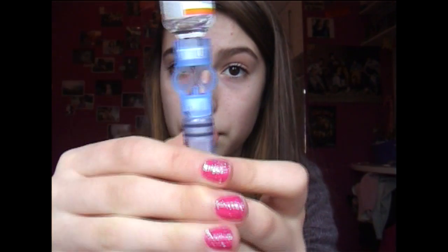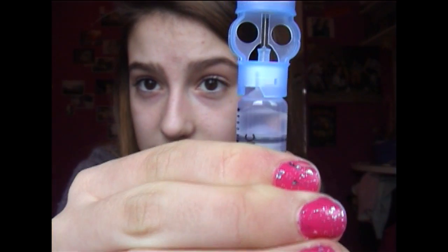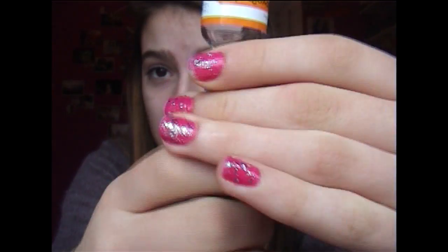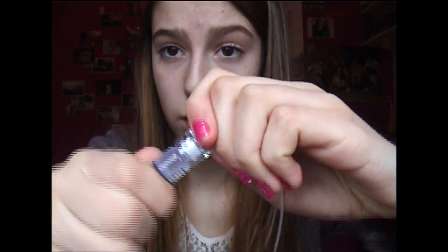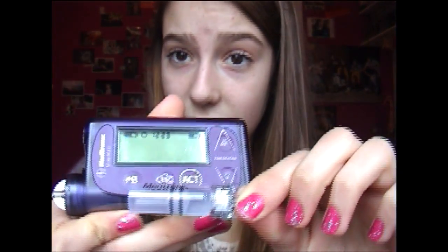I will then pull it back and as you can see the insulin is filling the tube. Once I've done that I just unscrew the top bit and I'm left with something that looks like this. I then get my set and plug it onto the top of my reservoir. That then just slips in there and I've done the set change.